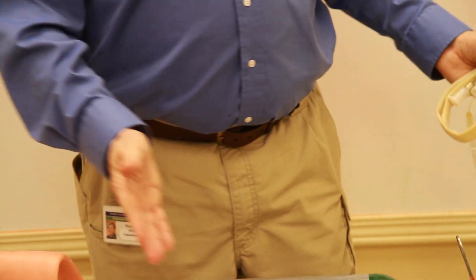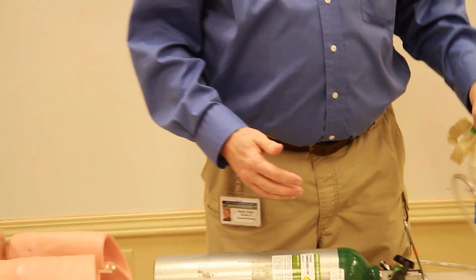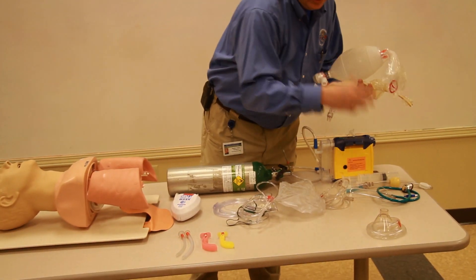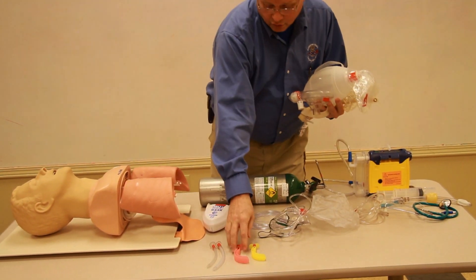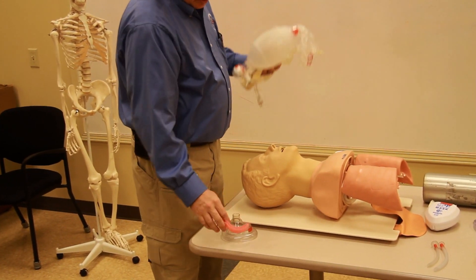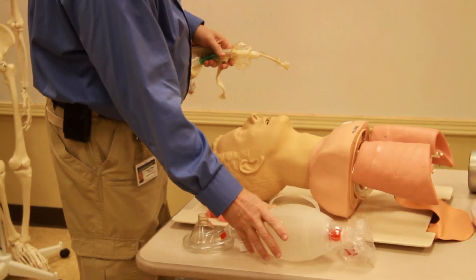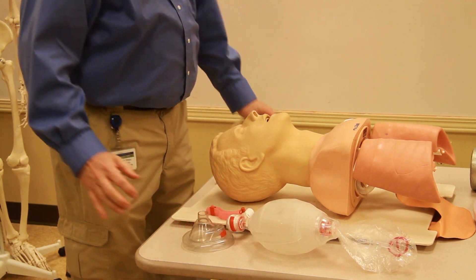As with any other airway, we have many tools we'll need to use: suction, stethoscope, bag valve mask, and the oropharyngeal airway. We're going to set this up with our patient — our mannequin.